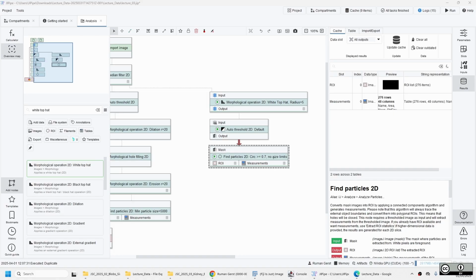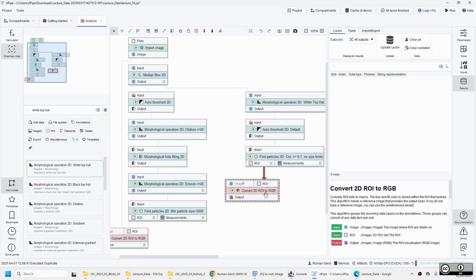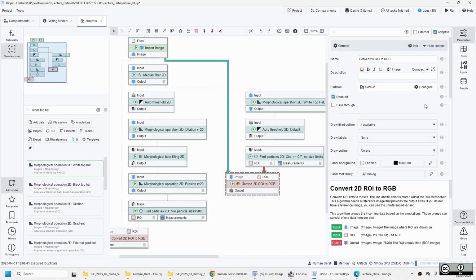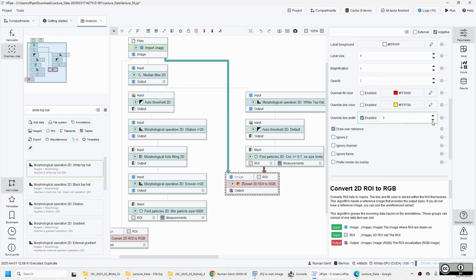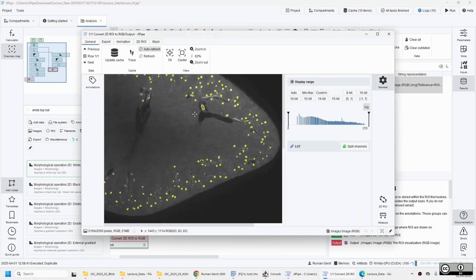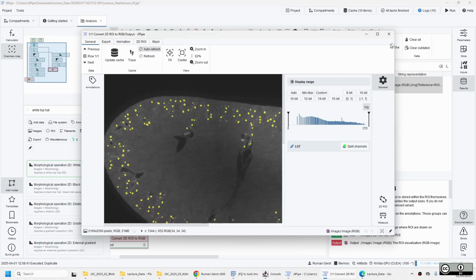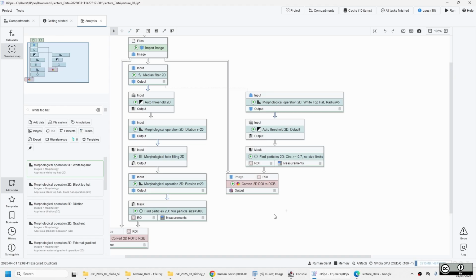And then let's finally draw them on top. So I can draw my glomeruli that were detected on top of the original image, to see what it does. Maybe I change the sizes a bit down, like 2, so they can be seen. It's somewhat okay. There's actually some additional fitting that can be applied to make it a bit better, but this is good enough for some tests. There can be some additional enhancement added.